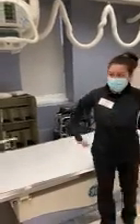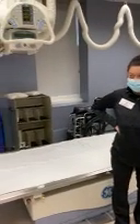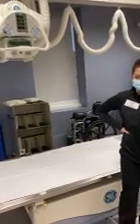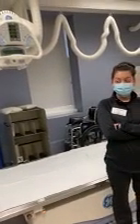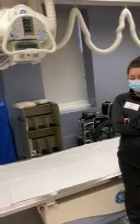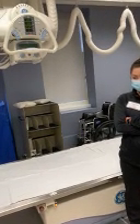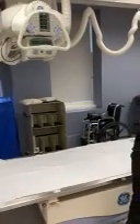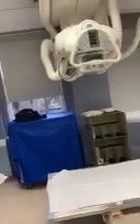Now, on this one, if you have an actual patient, you do want them to take off their pants, and potentially their underwear as well, because it may cause artifacts. So make sure you just gown them and then have them remove everything from the waist down. Now they don't necessarily need to take their shoes off for this exam, but if they're taking off their pants anyway, they're probably going to have to take off their shoes. Okay, but we're just going to demonstrate this on a fully clothed patient.